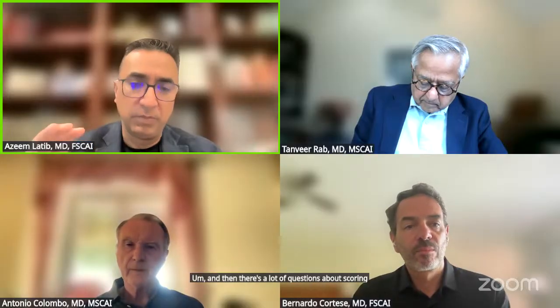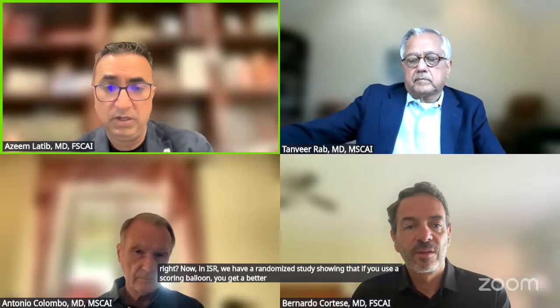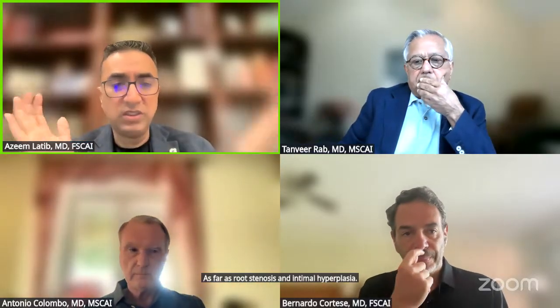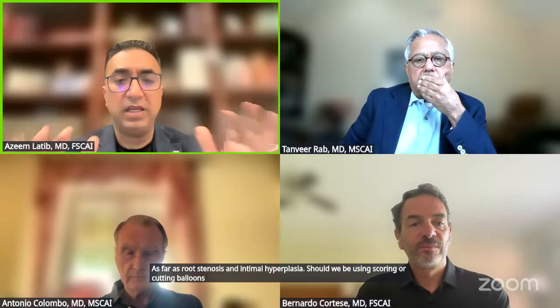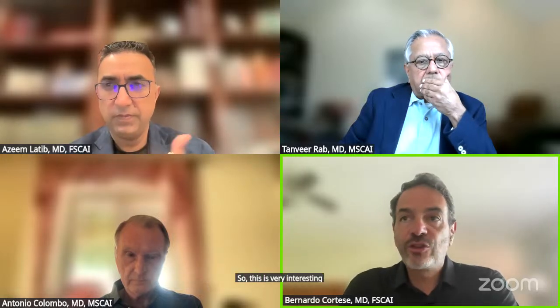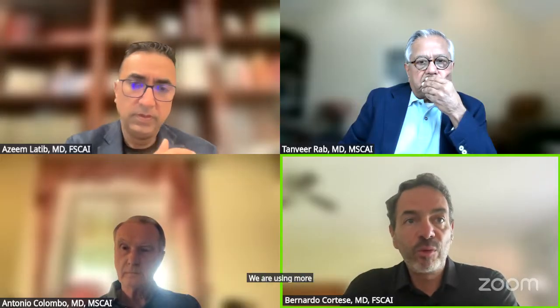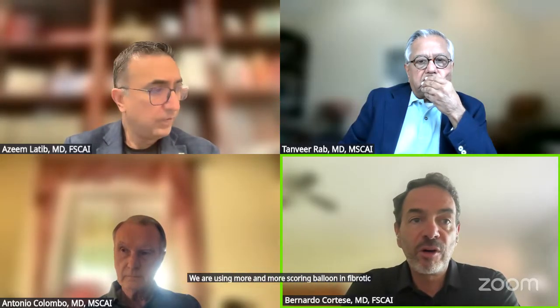Yeah. And then there's a lot of questions about scoring and cutting balloons. Right now, in ISR, we have a randomized study showing that if you use a scoring balloon, you get better outcomes as far as restenosis and intimal hyperplasia. Should we be using scoring or cutting balloons routinely in de novo disease? So this is very interesting. It's a very well taken question. We don't have definite data. We are using more and more scoring balloons in fibrotic and moderately calcific lesions, scoring or cutting. Cutting has a more powerful effect for sure, but it's less deliverable.